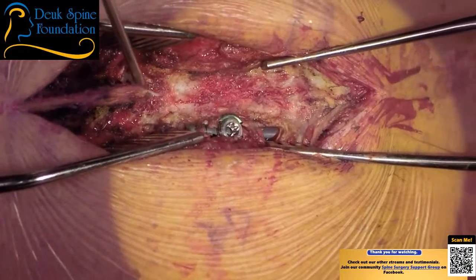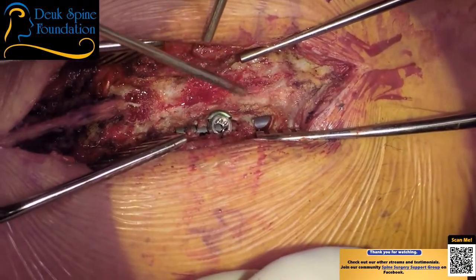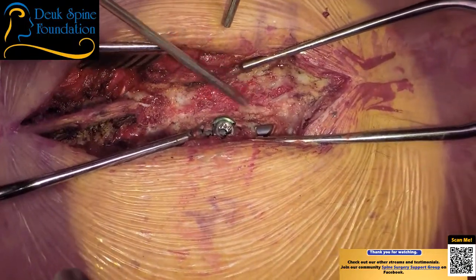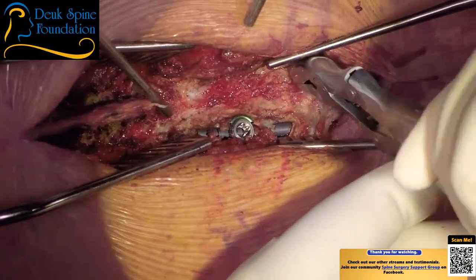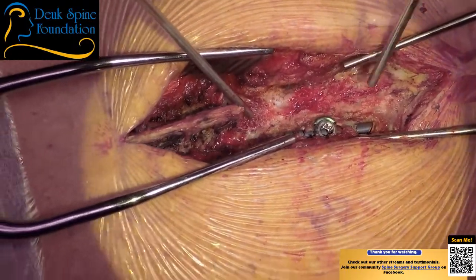There's the spinal cord right there. You see it? Right there. So it's kind of a scarred mess, but we're gonna get this done. All right. I'll need curettes and all that stuff in a moment. There's some scar tissue there. All right. I may want the drill now.